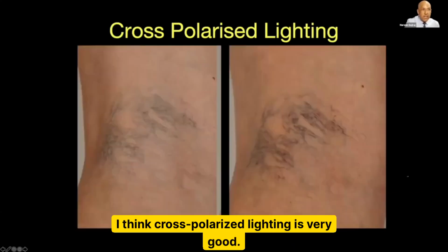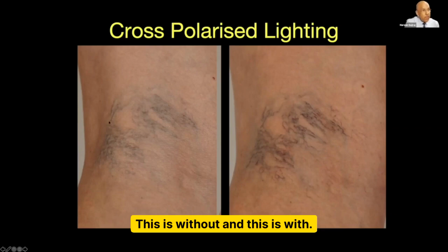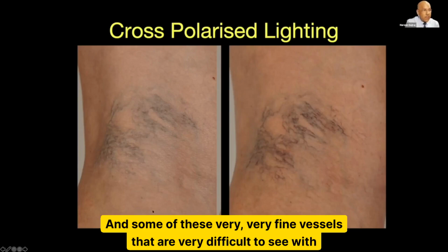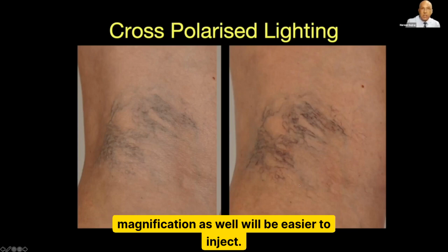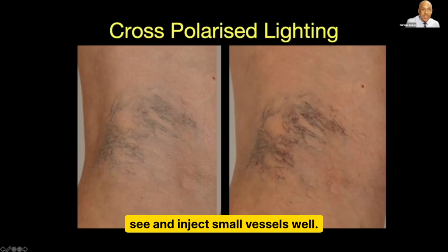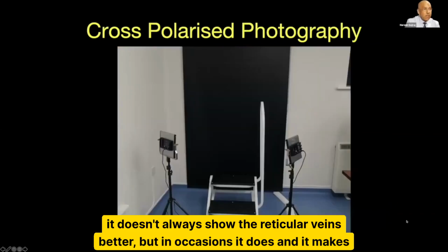I think cross-polarized lighting is very good. I do take photographs, particularly before and afters, using cross-polarization. This is without, and this is with, and what you see primarily is it takes away the glare, and some of these very, very fine vessels that are very difficult to see with magnification will be easier to inject. And certainly the Cirrus headlight or a similar cross-polarization system will allow you to see and inject small vessels well. It doesn't always show the reticular veins better, but on occasions it does, and it makes them easier to inject.